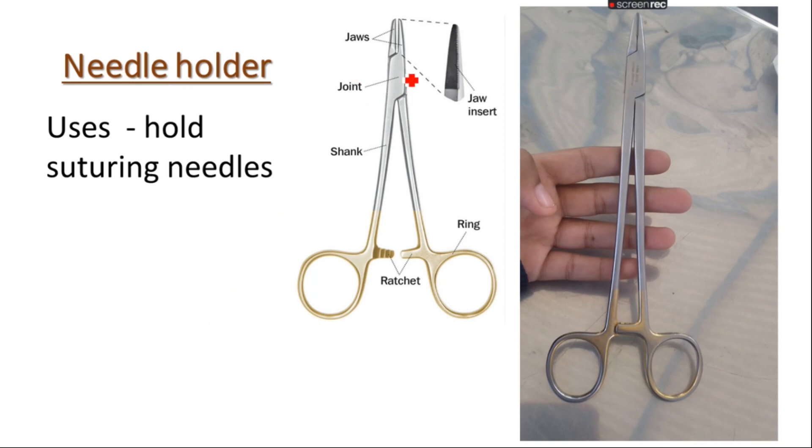If we talk about the particular parts of the needle holder, these are jaws, joints, shank, ratchet, the rings, and the jaw inserts.